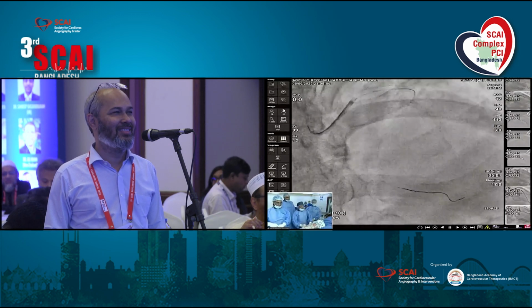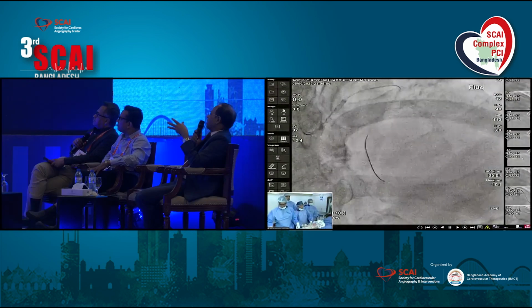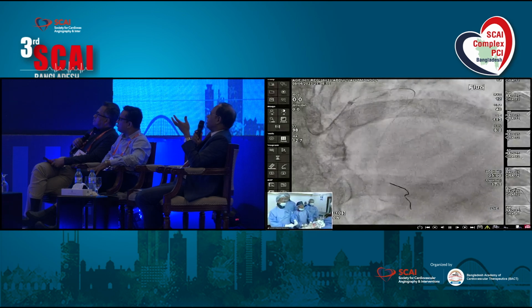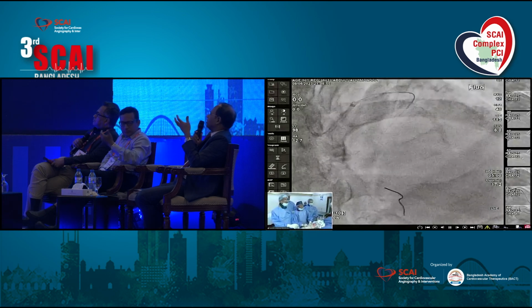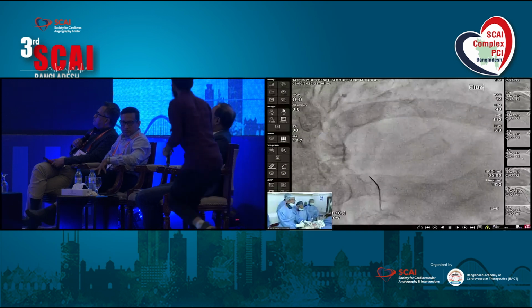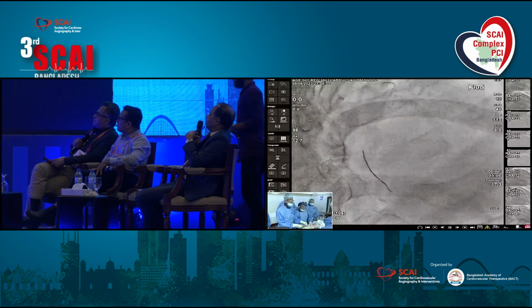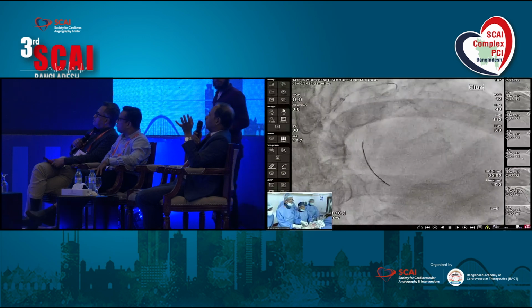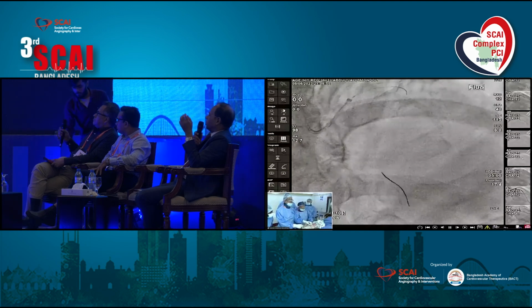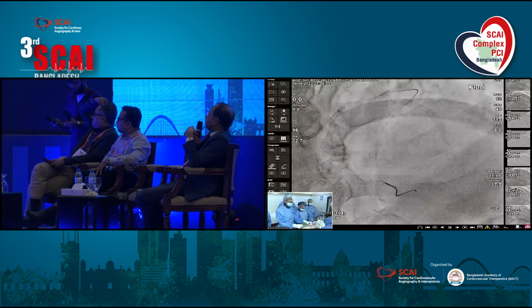So that LAD is a great learning, especially for the juniors and for us also, regarding the vessel preparation, pre-stent IVUS findings. Approximately it is 4 millimeter. Angiographically it is difficult to understand that it is 4 millimeter, but it is really 4 millimeter proximally. So definitely without IVUS, we usually used to put up to 3.5 post dilatation. So definitely that is not good for long term.